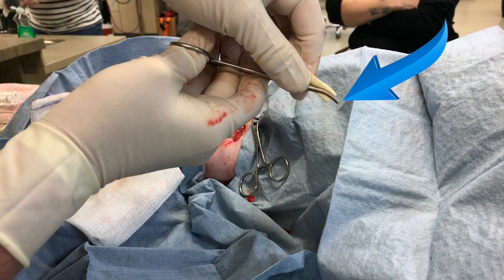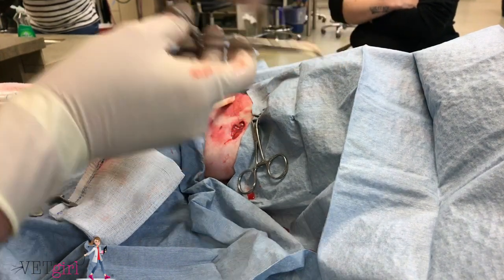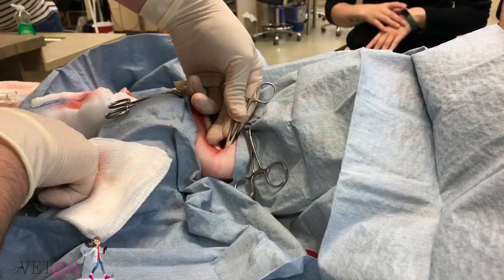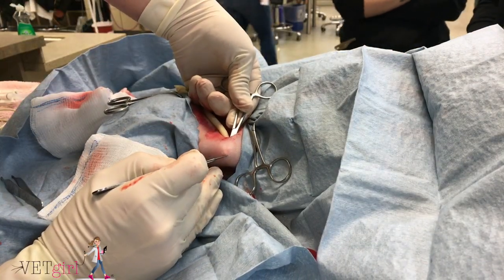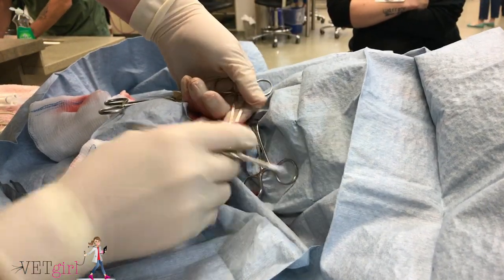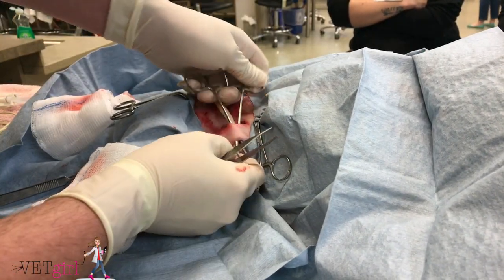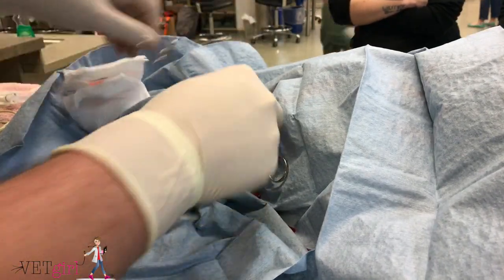As you can see in this video, the drain is clamped with the hemostat so that the tip of the hemostat is more distal than the drain itself. This allows the clinician to place the hemostat blindly in the ventral wound pocket and use a scalpel to create a stab incision to allow the exit of the drain without accidentally cutting the drain. We don't want a piece of that drain accidentally cut off and left in the wound, so you're using the hemostat as a cutting guide.